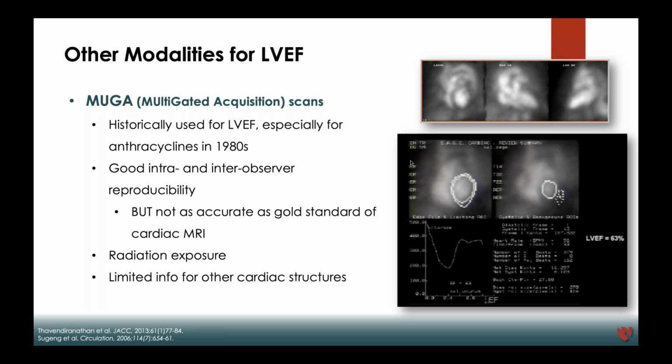Yeah, at the institution I trained at, the oncologists often ordered MUGAs, and we were reading like 1 or 2 MUGAs a day. But if a cardiologist was ordering it, generally it ended up being contrast echo. Moving away from historical use would be fantastic, because now we have contrast enhanced echo, which is very accurate if you're able to see the heart well. So maybe with our updated guidelines, we'll have more clear recommendations.